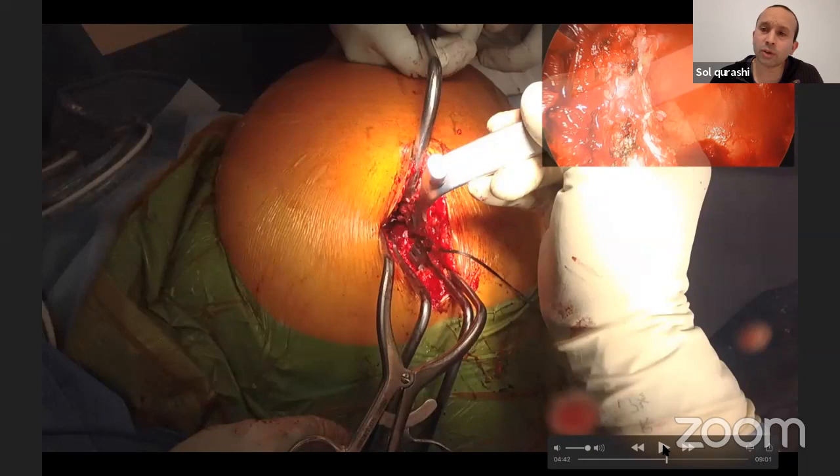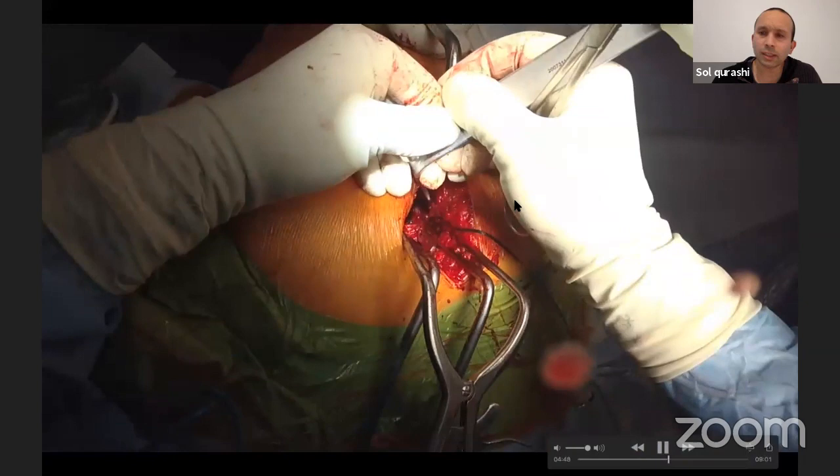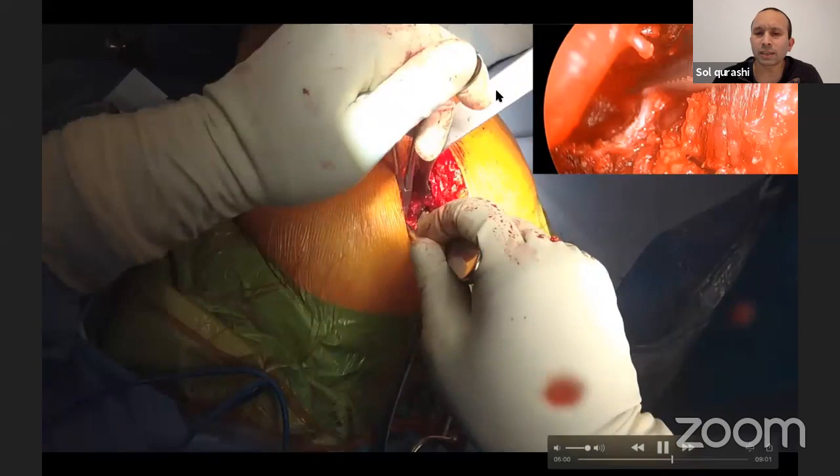Okay, so here I'm putting the Homan inferiorly, and I don't know if you can make it out, but in front of that Homan, you can see that, okay, here's the posterior wall rather. And again, take out the labrum. Posterior inferiorly now. There's an osteophyte there as well. If it bothers you, you can knock it off now, like I am there with the osteotome.